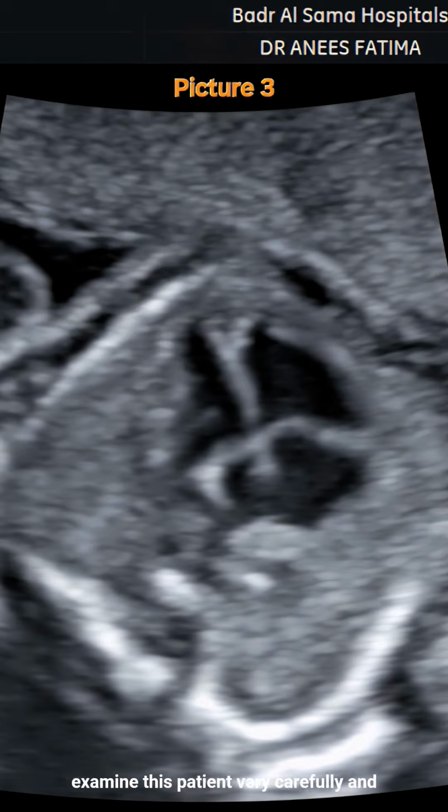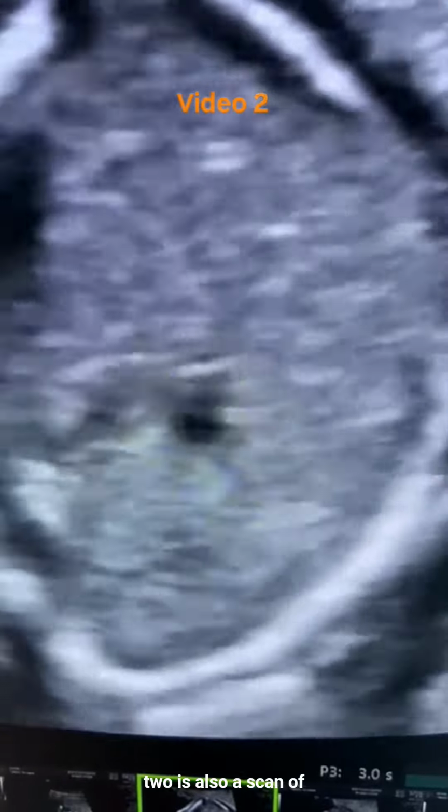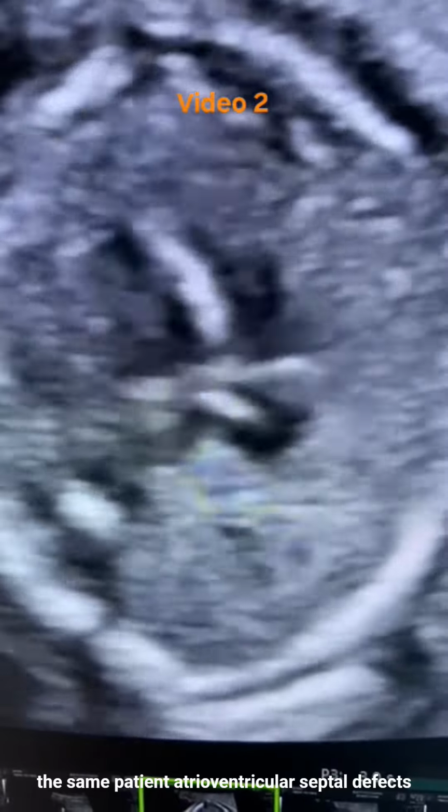You will have to examine this patient very carefully and thoroughly for any and all signs of AVSD in different views. I had performed the scan on this patient at 19 weeks and 3 days gestation. Unfortunately, the baby had neonatal death on day 4. Video 2 is also a scan of the same patient.